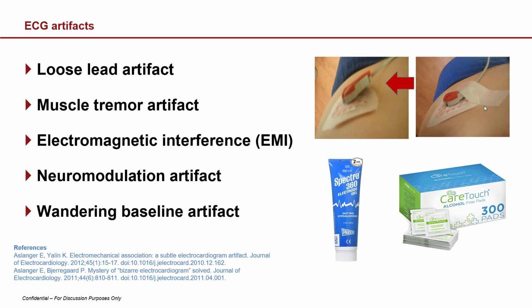Now, if you're new to cardiac CT, consider buying individual ECG leads rather than the bulk pack of 50 or 100, because those tend to dry out over time, and those can make it hard for your system to be able to see the patient's actual heart rhythm, because there's not enough of that wet electrode left on it to conduct the electrical activity of the heart so the scanner can identify when to modulate the exposure.